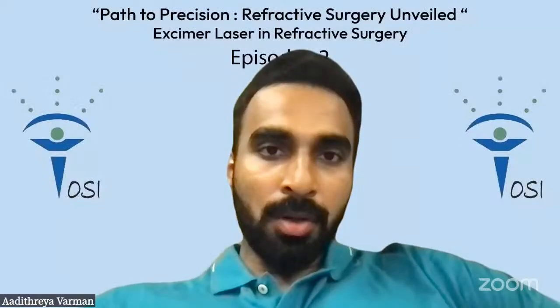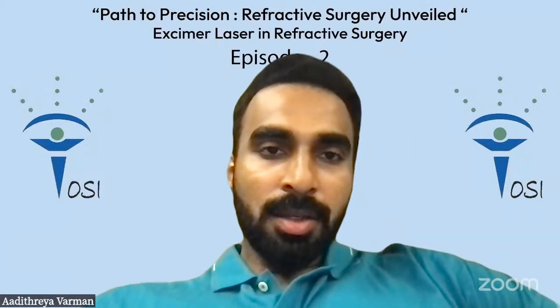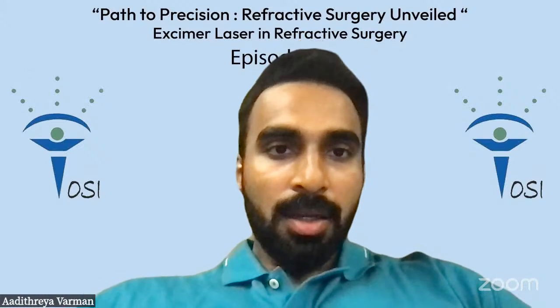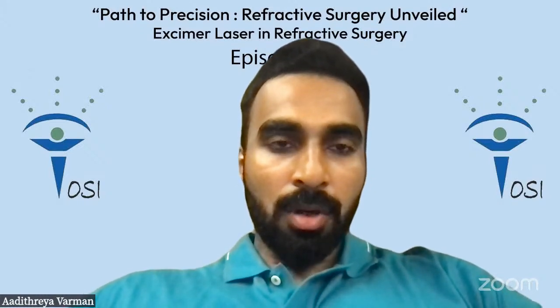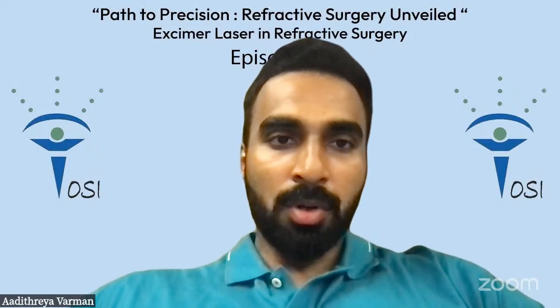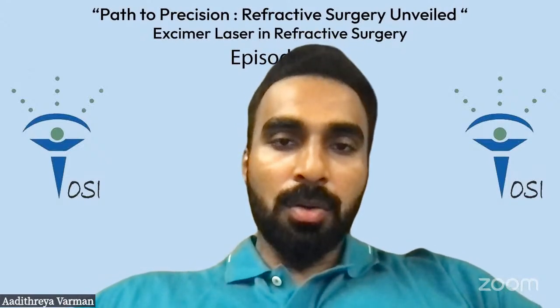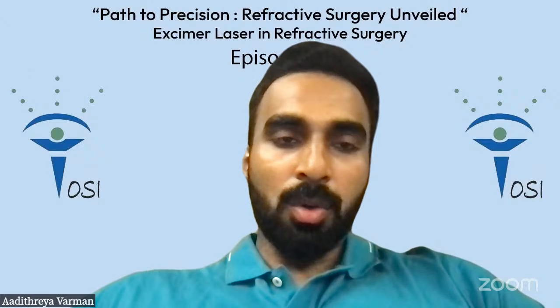Yes. So thank you, Dr. Lippy. Just like Zain said, there's one more thing I'd like to add about the flap repositioning. What I do is I follow Dr. Dan Reinstein's three-step protocol for flap repositioning to avoid microfolds. One important thing is to avoid overhydration.